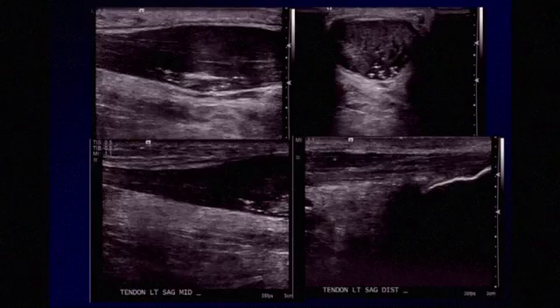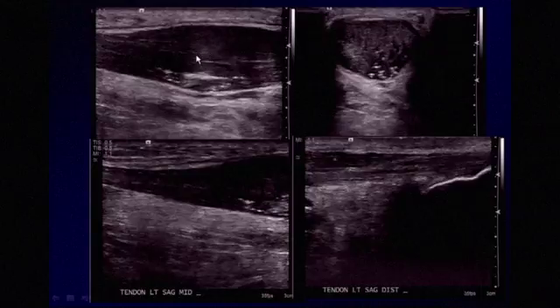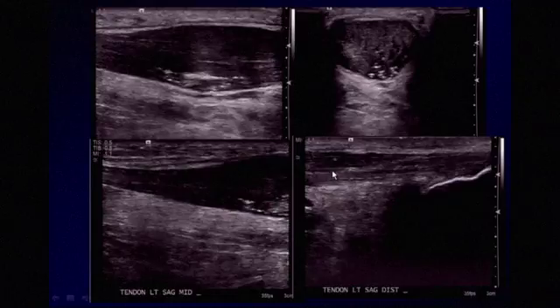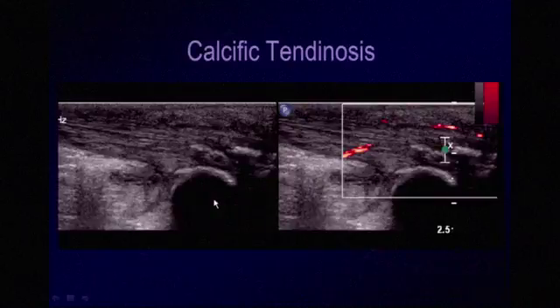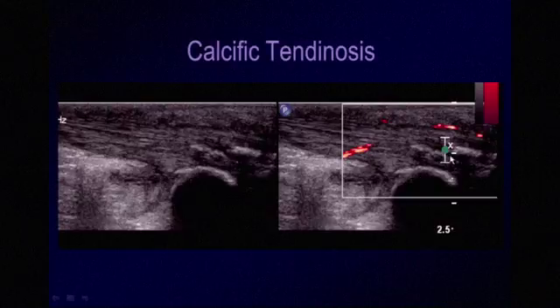With more advanced or severe cases, you may completely lose normal tendon architecture. Here we see an Achilles tendon that is significantly thickened and hypoechoic with lost normal architecture. Note that the tendon is not involved at its insertion but rather proximally, closer to the myotendinous junction. Over time, calcium may form within the tendon. This is a case of calcific tendinosis, with calcifications visible within the tendon just near its insertion onto the calcaneus.